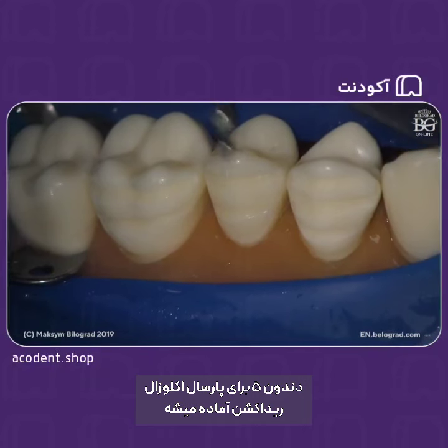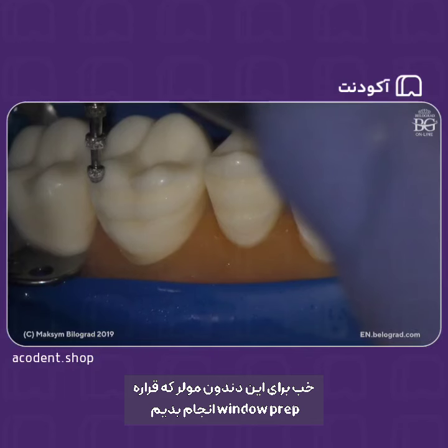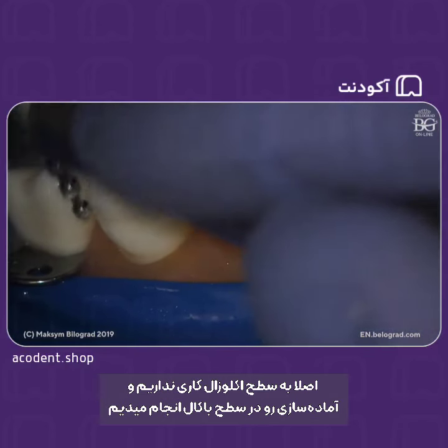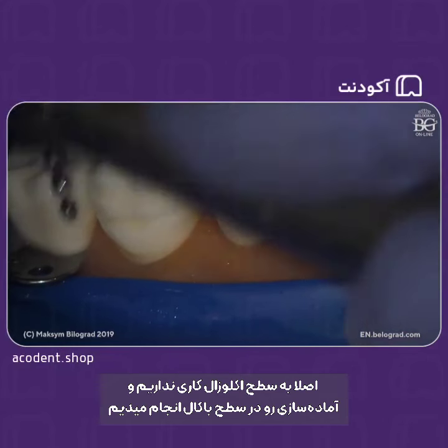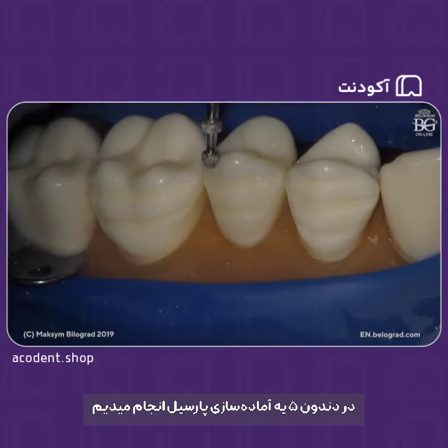This premolar will be prepped for partial occlusal reduction. This one will be with a full occlusal coverage. So this molar window prep, we will not do anything from the occlusal surface. We will just keep these preparations on the buccal surface. This premolar, we will do some partial preparation.